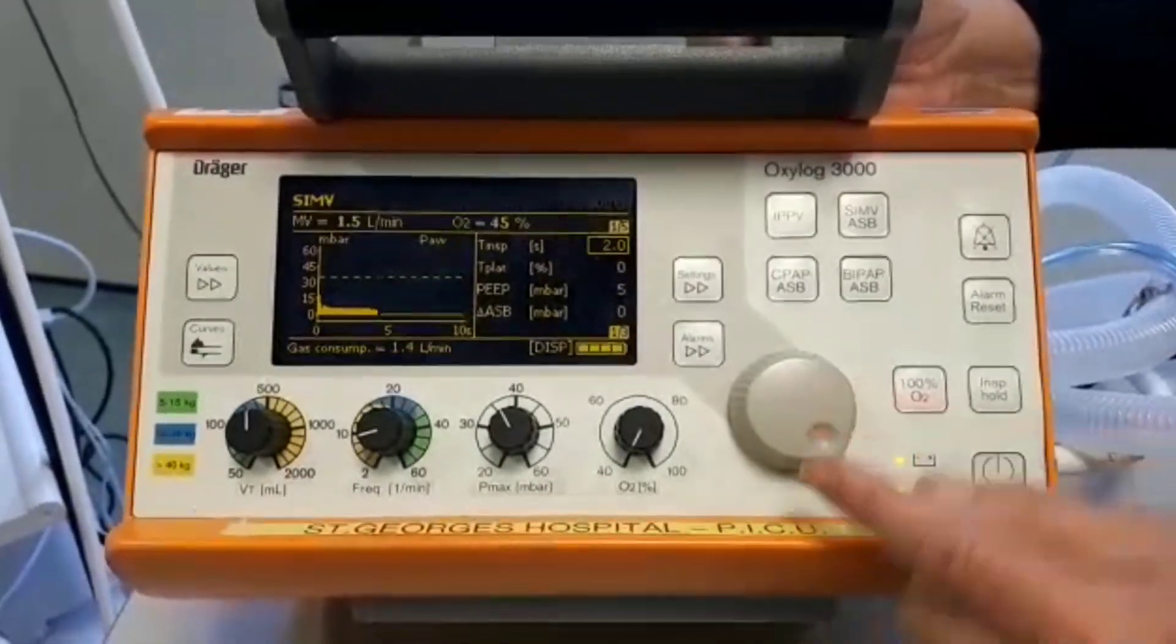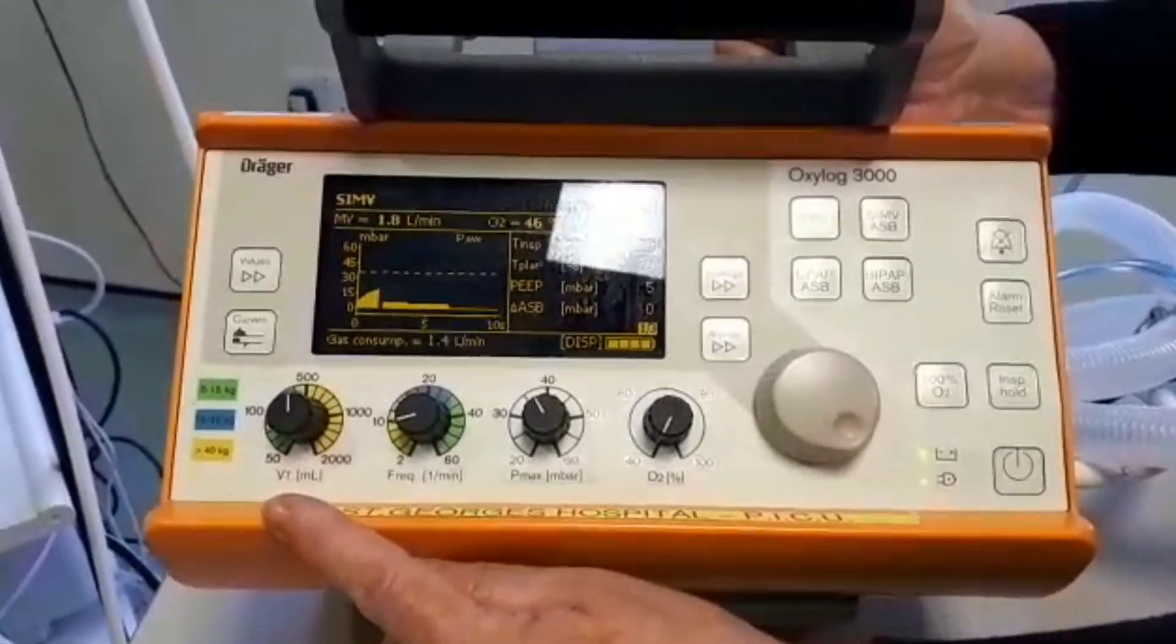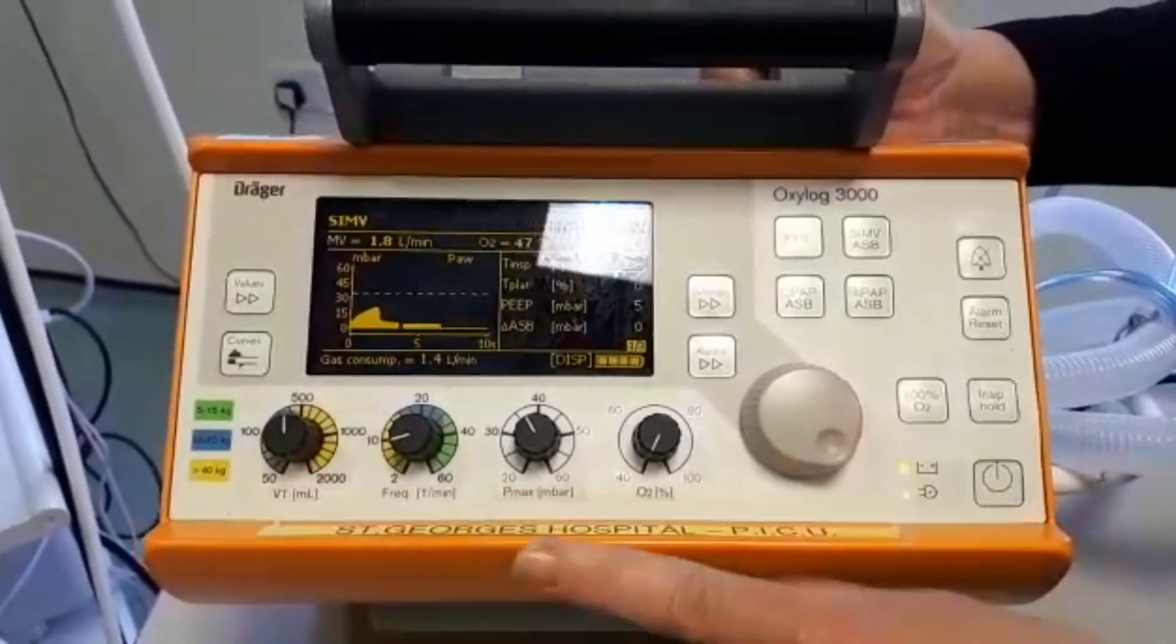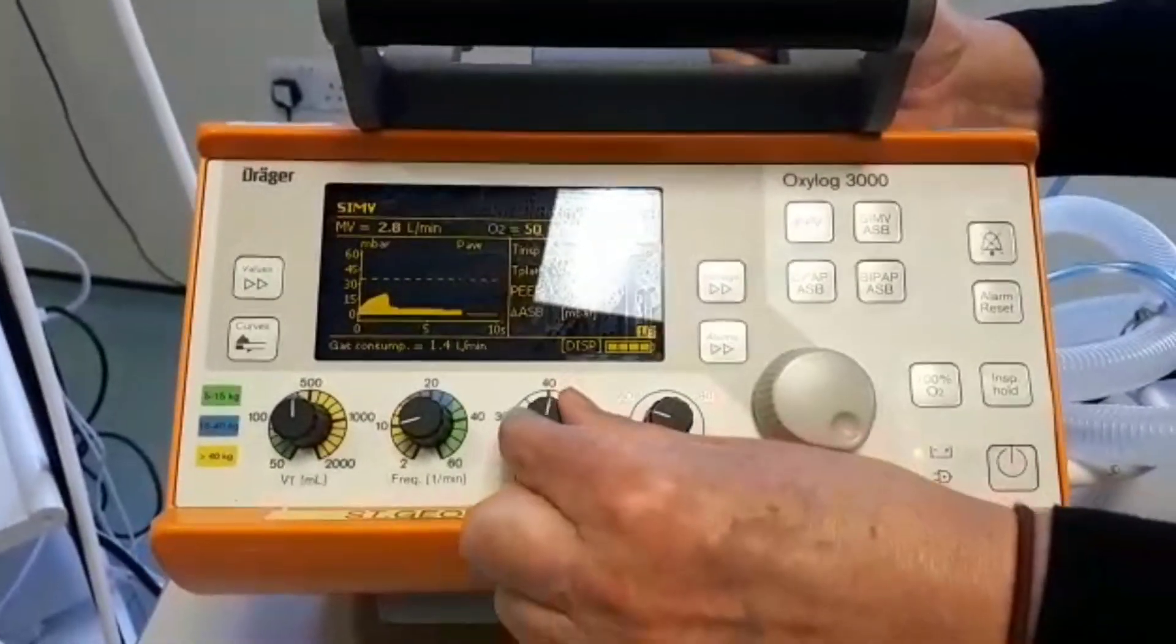To set any settings, we have four hard controls here. One for tidal volume, frequency, pressure, and oxygen. And you can adjust them just by turning the control.